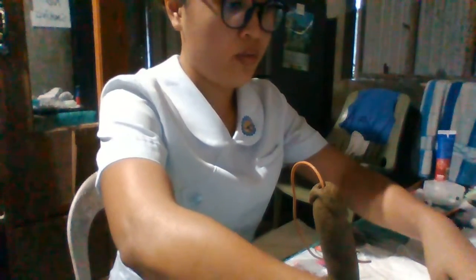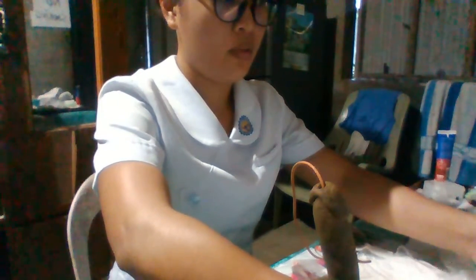Then afterwards, we're going to inspect the condition of the urethra.